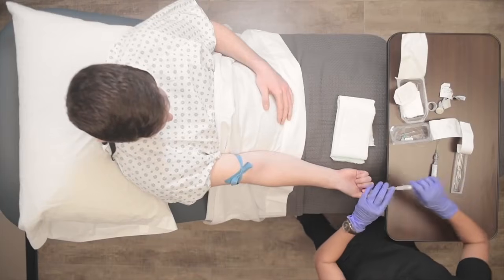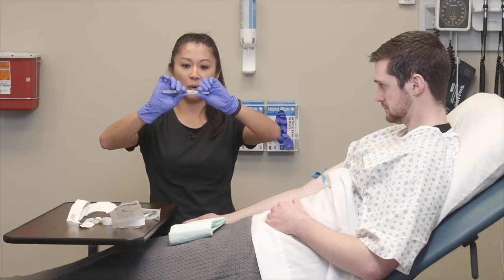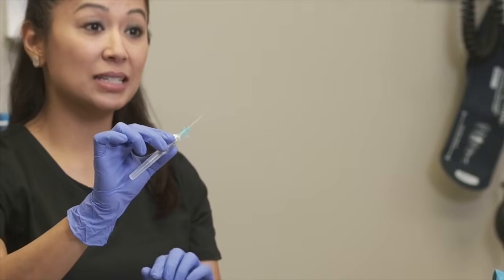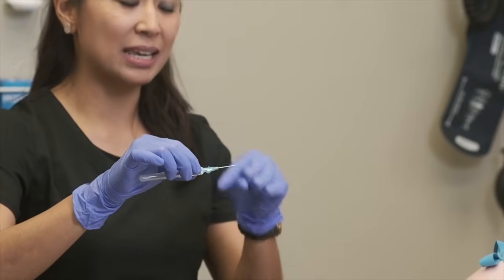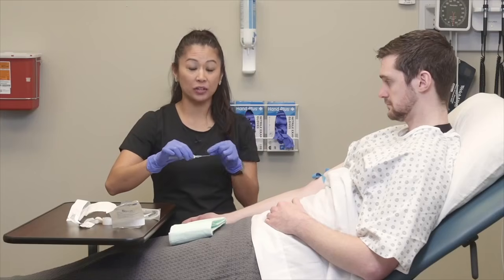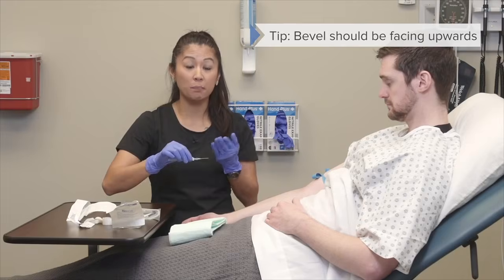All right, so now I can get my catheter ready. When I have my catheter for needle safety, I want to make sure I go straight out. Every device is a little bit different, so we need to keep that in mind. And before we puncture the skin, we need to be able to see the bevel up. What that means is when I look down at my catheter, I can see a little bitty hole, and that's what we want, bevel up.